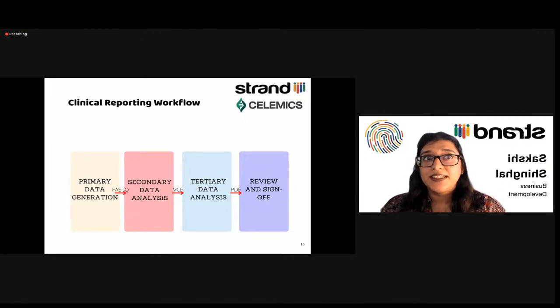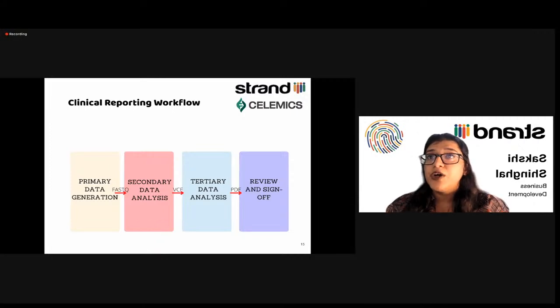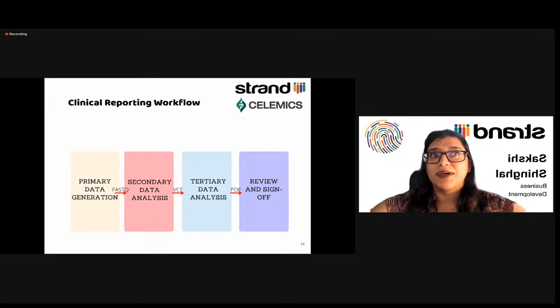So now, thanks Ernie for that introduction. Now that we have our VCFs ready and we have our demographic data available, it'll be handed over to Strand, where it can be uploaded to StrandOmics so that a tertiary data analysis can occur, and you can create a PDF, which will then be reviewed and signed off by experts for delivery. I will hand it off now to Urvashi to explain that aspect of everything.